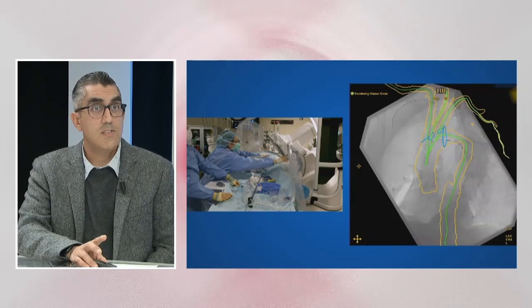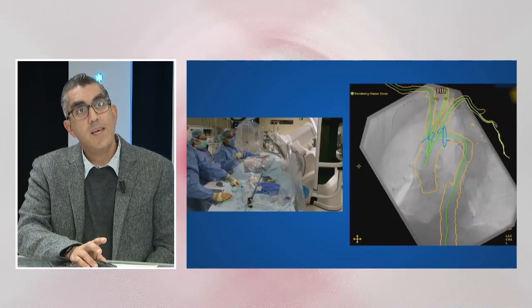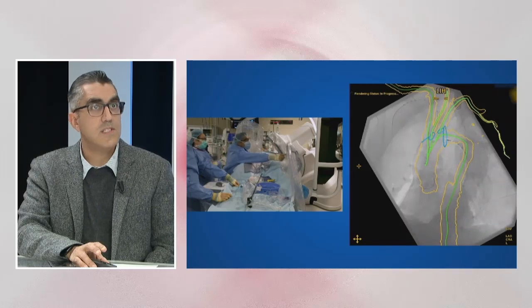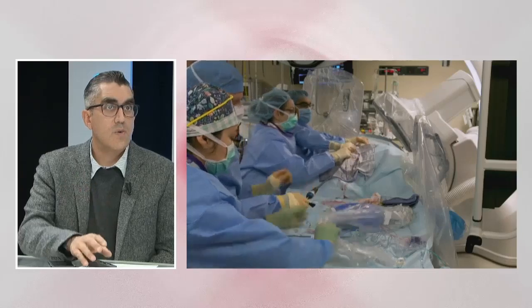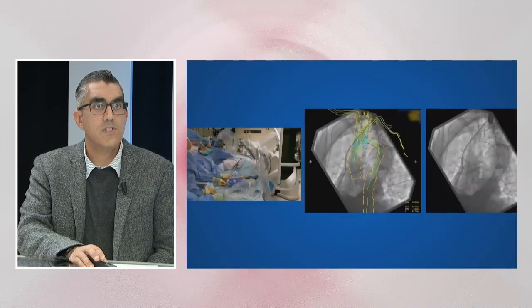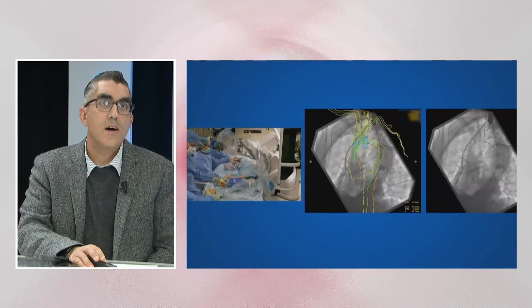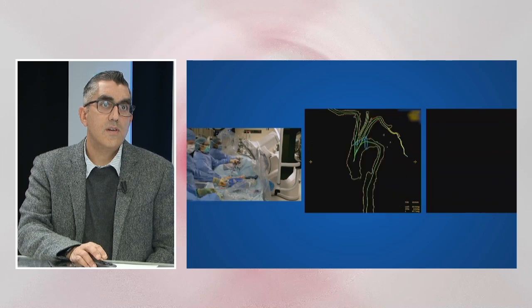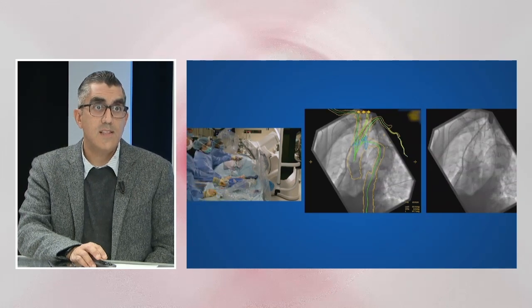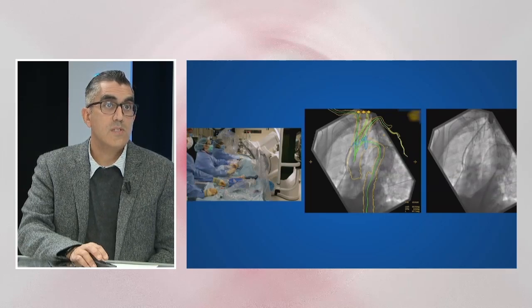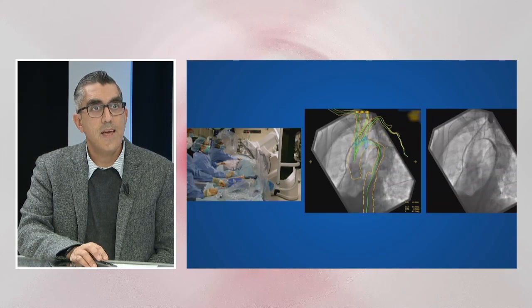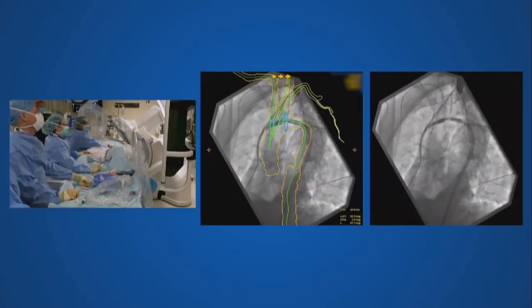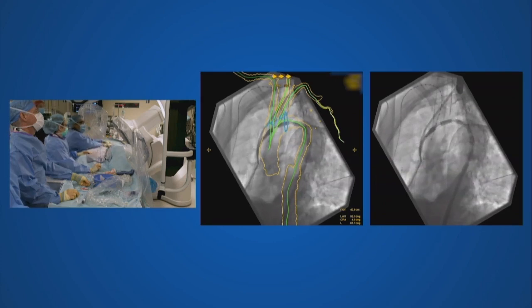Our imaging catheter is from the right arm, as you can see. The registration can be affected by wire stiffness, but at this point we're mainly interested in the origin of the left subclavian. You can see us delivering the first device, and keep your eyes on the device as it navigates through to our large blue circle, which was done preoperatively on the Advantage workstation. The device navigates the aorta nicely — you deploy it and bring it back.